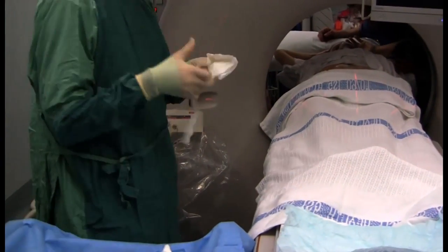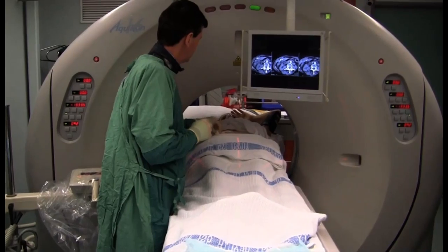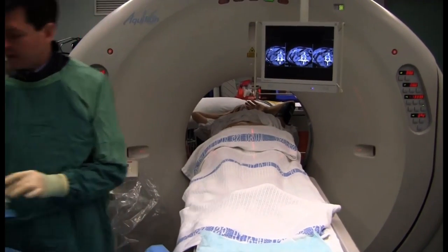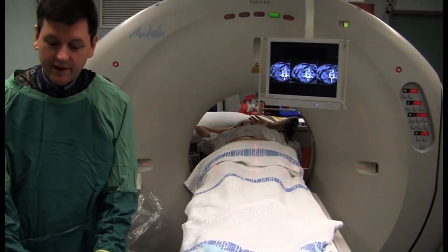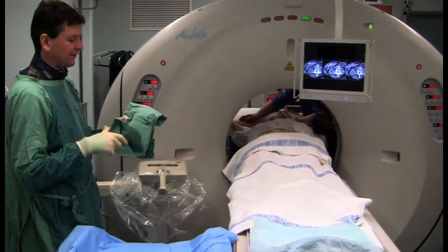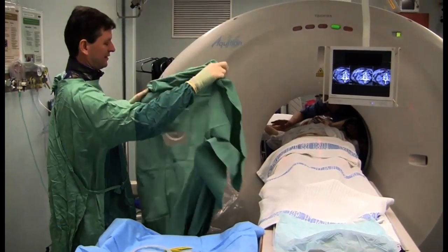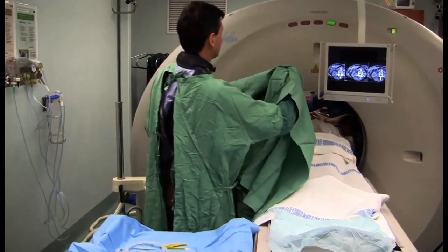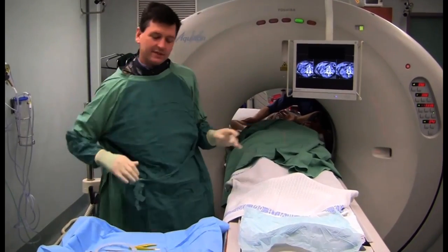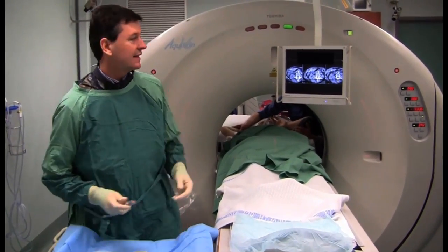Current situation: we've given 50 micrograms fentanyl and 2.5 milligrams midazolam IV. The lady's still talking to us despite dropping about 40 millimetres of mercury systolic pressure — but we haven't started doing anything beastly to her yet, which will almost certainly increase her blood pressure. Standing by for local anaesthetic.